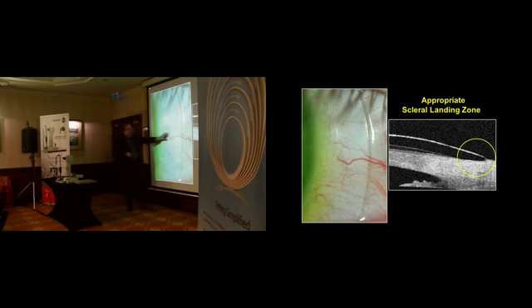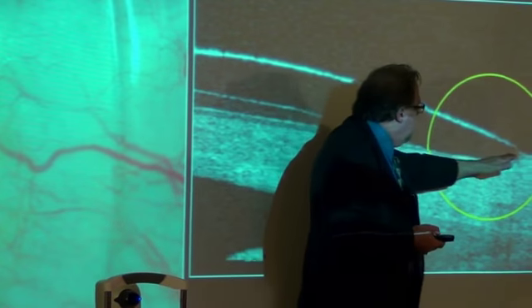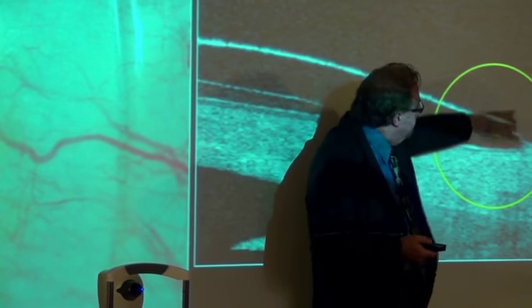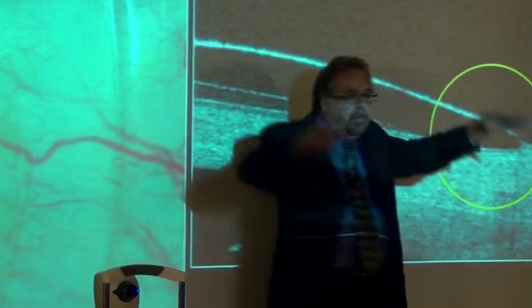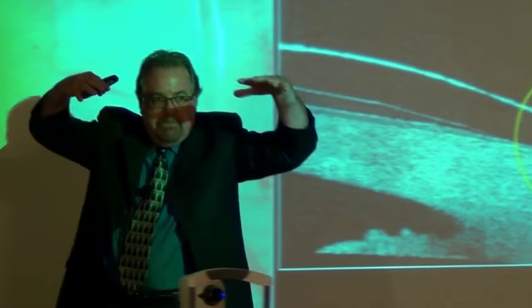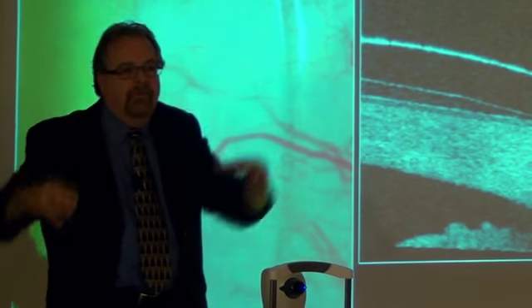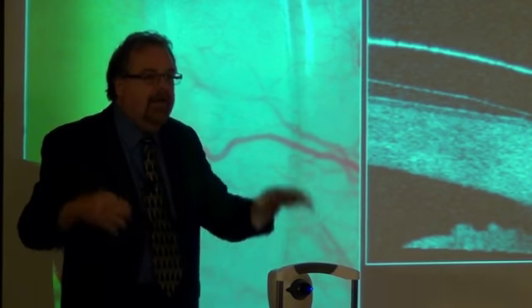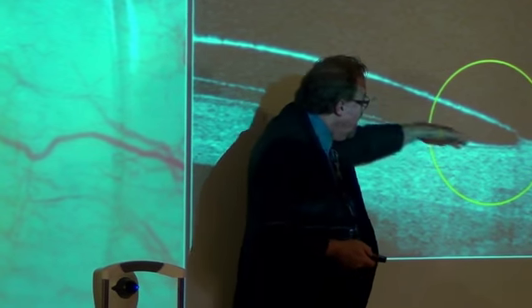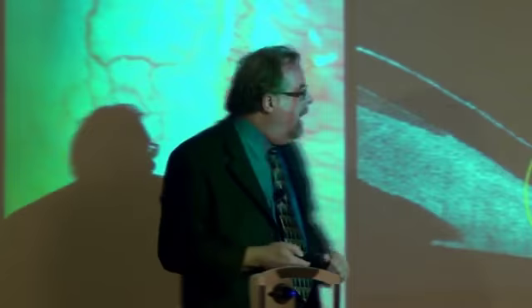You see, here we see a contact lens that is coming down with its angle and then beginning to make its motion up. 50% of the lens edge is above the surface of the eye, 50% is in the conjunctiva. It is actually compressing in that area slightly. There's no way to avoid this with this kind of lens diameter. It's going to find its area of rest and then begin its departure from the surface of the eye.